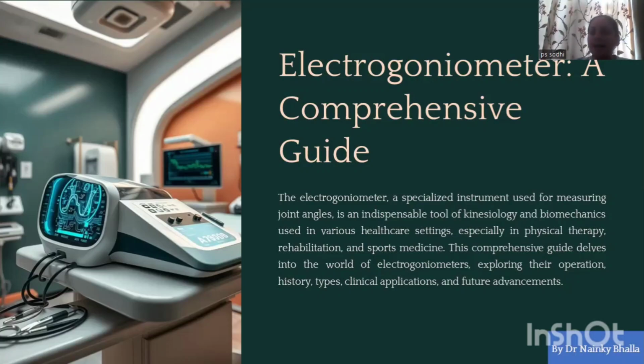It is a specialized instrument used for measuring joint angles and is an indispensable tool of kinesiology and biomechanics, used in various healthcare settings, especially in physical therapy, rehabilitation, and sports medicine. This is going to be the importance of it.